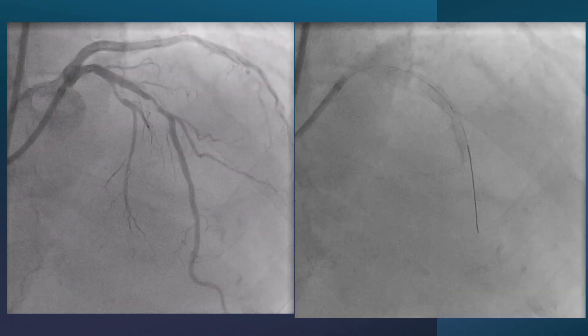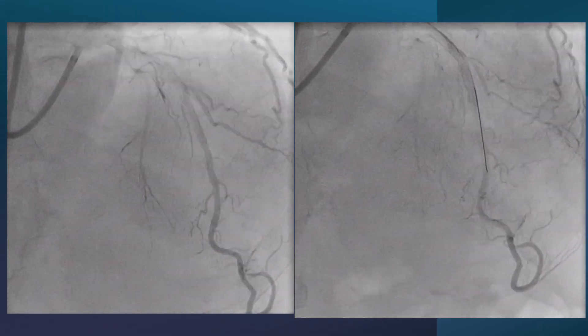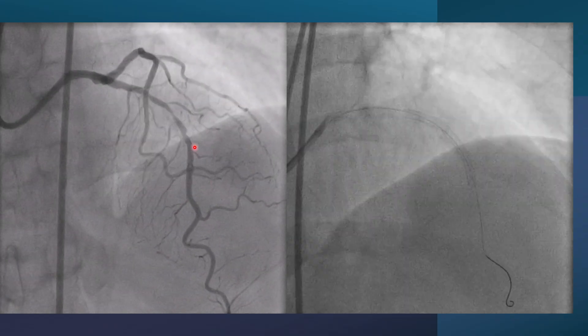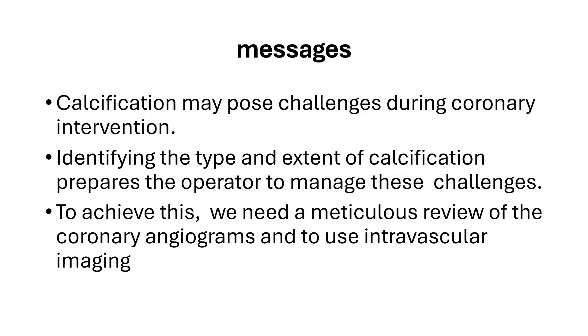Looking at both cases together: the first case — a man with hypertension and atrial fibrillation — achieved a good result after high-pressure balloon dilatation without debulking. The second case — the female — required rotational atherectomy, and this is her result. The message from these two cases is that calcification may pose challenges during coronary intervention. Identifying the type and extent of calcification prepares the operator to manage these challenges. To achieve this, we need meticulous review of the coronary angiogram and the use of intravascular imaging. Thank you.